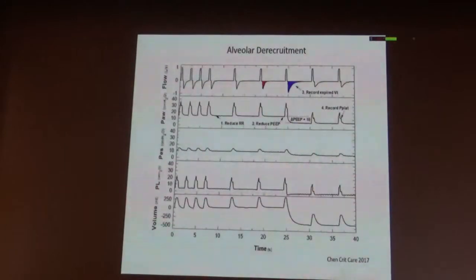And we just look at the next breath expired on the ventilator and record the expired tidal volume. Of course, before this maneuver, inspired volume and expired volume are the same, but then you have a much bigger expired volume. So if we subtract the inspired volume, we have the volume which was kept by this PEEP level of 15 above the PEEP of 5.